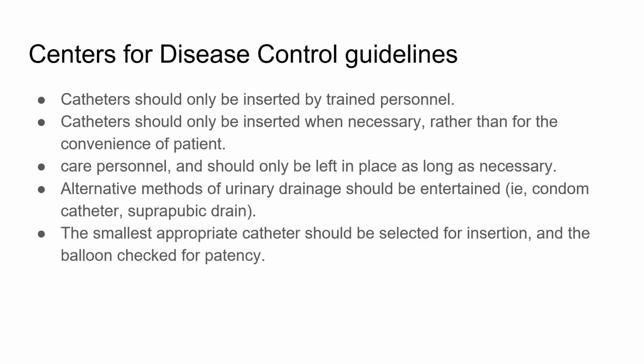So moving on, the guidelines for catheterization that have to be followed according to the Centers for Disease Control guidelines. Catheter should only be inserted by trained personnel, as I said earlier. The catheter should not be inserted without understanding the technique and its procedure. Catheter should only be inserted when it is necessary rather than for the convenience of the patient. It should be done only when the patient's condition demands the catheterization, not when the patient care personnel demand a catheterization.